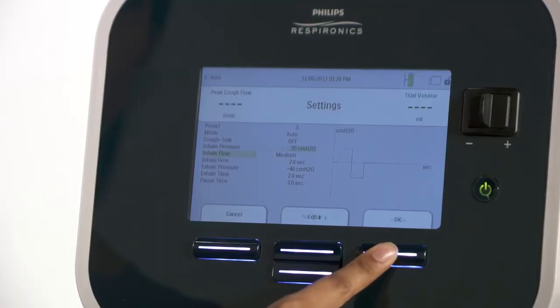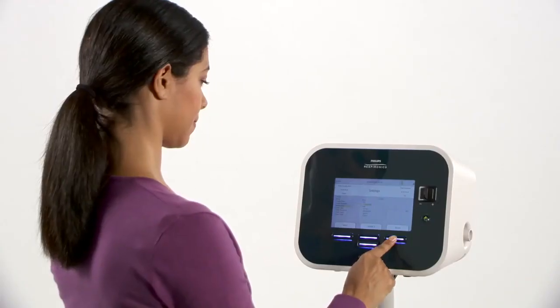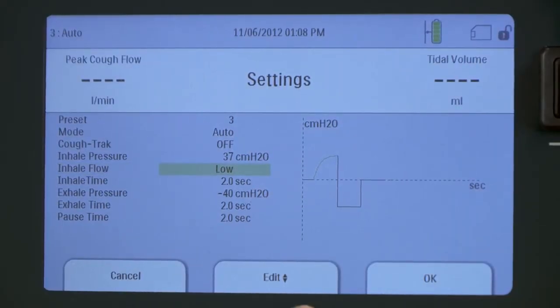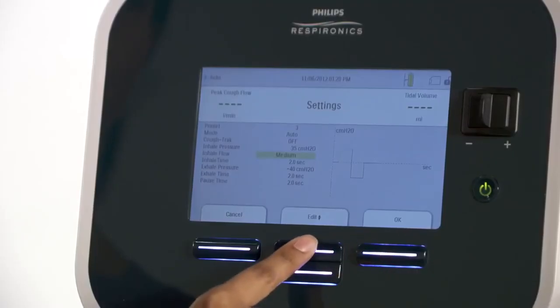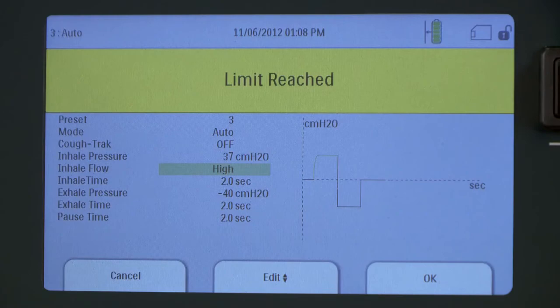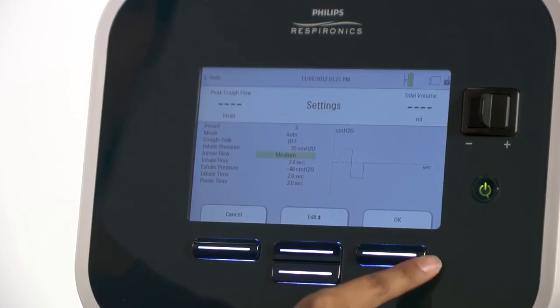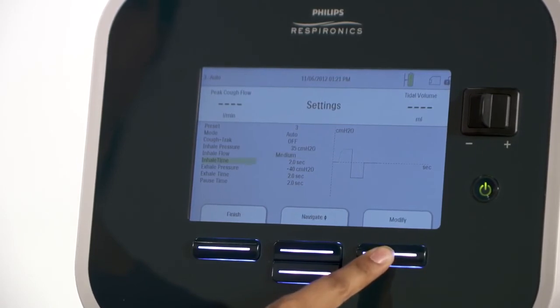Press the right button under OK. Press the right button under Modify to change the next item on the list, which is Inhale Flow. Use the Up-Down Edit button to adjust. If you try to change a setting beyond the available parameters, a Limit Reached message appears. In this case, after you have entered the correct pressure, press OK to accept the new setting.